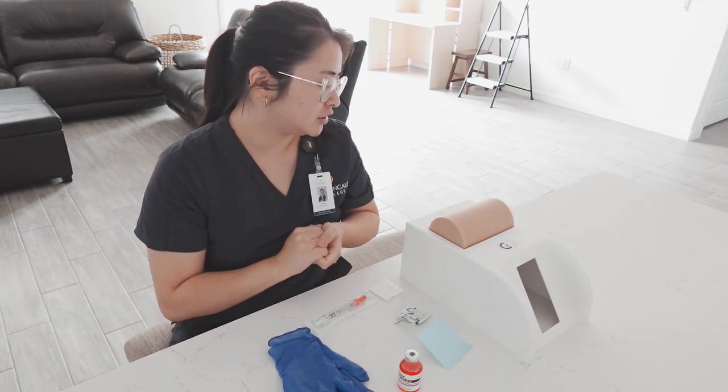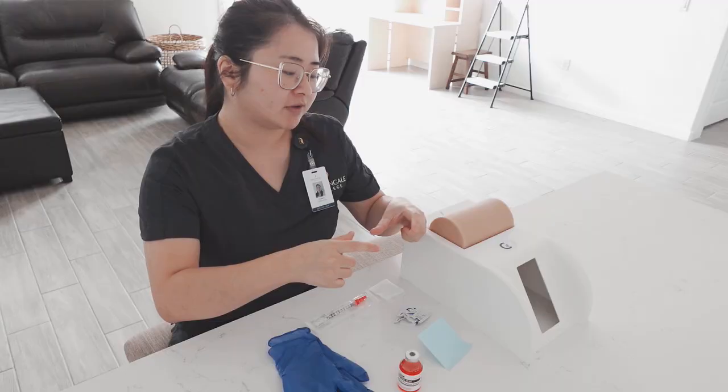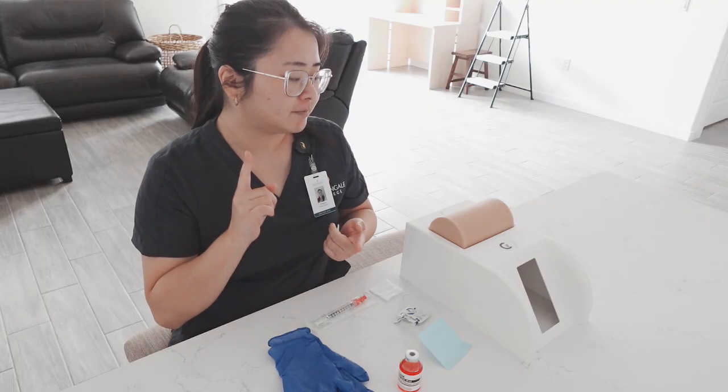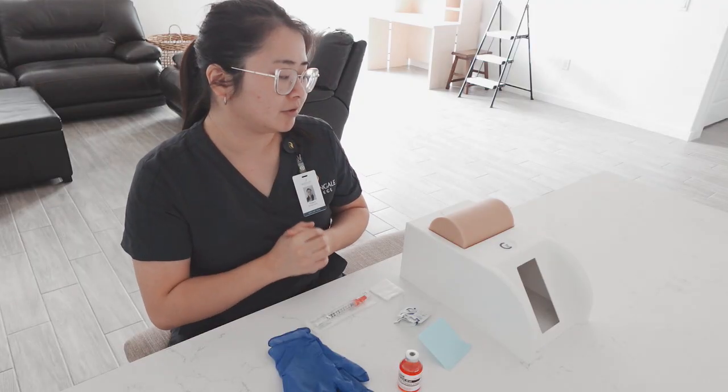Hi, my name is Vivian. I'll be your nurse today. Can I have your full name and date of birth? I'm going to check their wristband for 2-patient verification. Is the correct patient? Okay, Mr. Smith, are you allergic to any food, medication, or any environmental factors? No? Perfect. Give me 1 moment, okay?